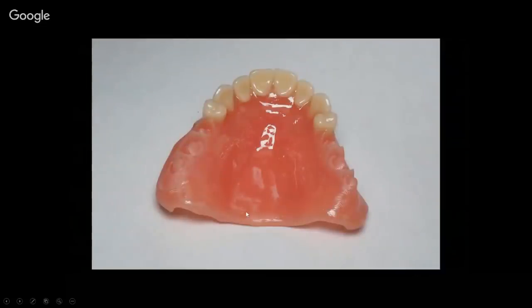All right, so now we're bonding teeth in. If I planned these with the Nobilium T7 teeth and L7 lower anteriors and the 32U and the 32L posteriors, I'm going to just go grab those teeth. I would recommend cutting in some additional retention. Again, you're just trying to hedge your bets to make sure you've got as much retention as possible. Apply bonding agent to the teeth and to the base.